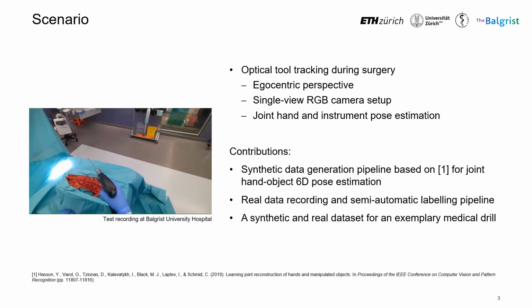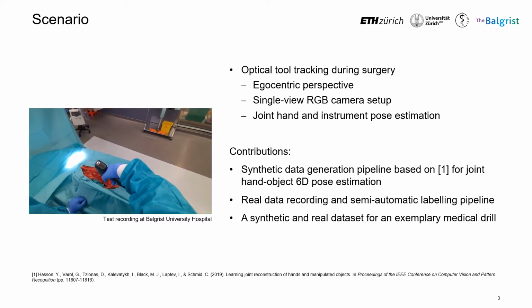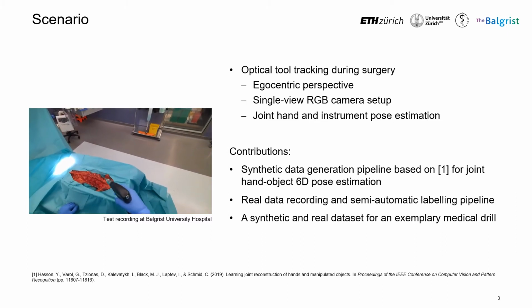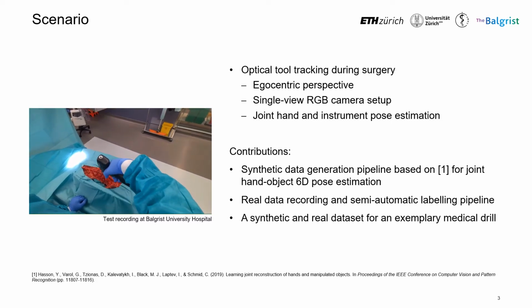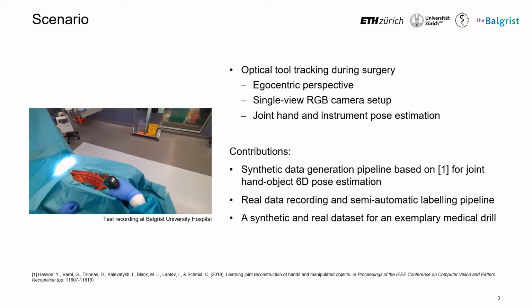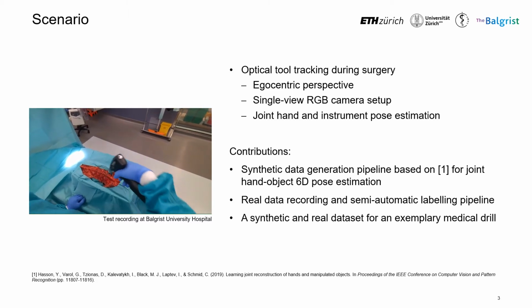In our paper, we propose two data generation pipelines. First, we implemented a synthetic data generation pipeline to create realistic RGB patches for our scenario. Second, we propose a semi-automatic labeling pipeline to create a real dataset, which can be recorded in a mock-up operating room. We focus on drilling as an exemplary application, as bone drilling is conducted in about 95% of orthopedic interventions.